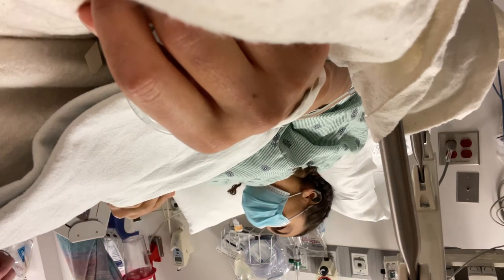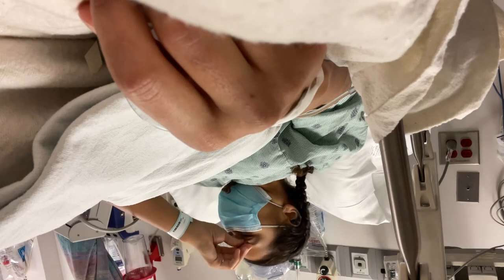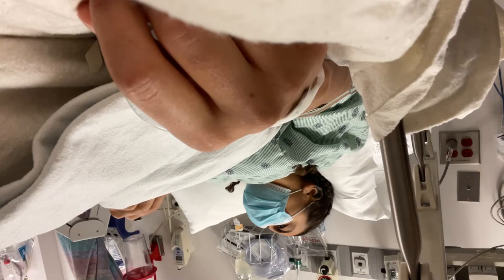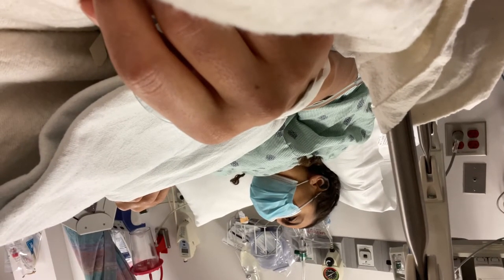There are no side effects — not one bit whatsoever. We recommend the first two to three days as much as you can tolerate. If you're having trouble sleeping or want to take a little break from it, totally your call. Now the battery life — you're going to feel it weakening around the hip. A low battery indicator pops up in the box, like the one you see on a cell phone. The most important thing: before you go grabbing for a new battery, always, always, always turn it off first, then change your battery. If you put a new battery in with this thing on and hooked up to you, it is going to let you know very quickly that you don't do that. You don't do it twice.